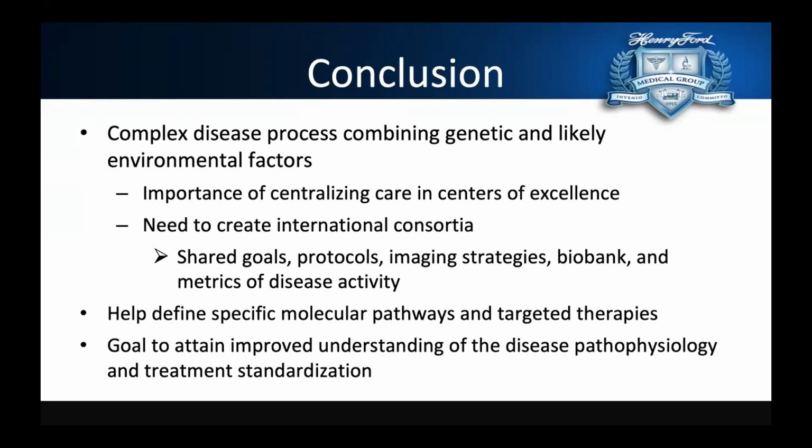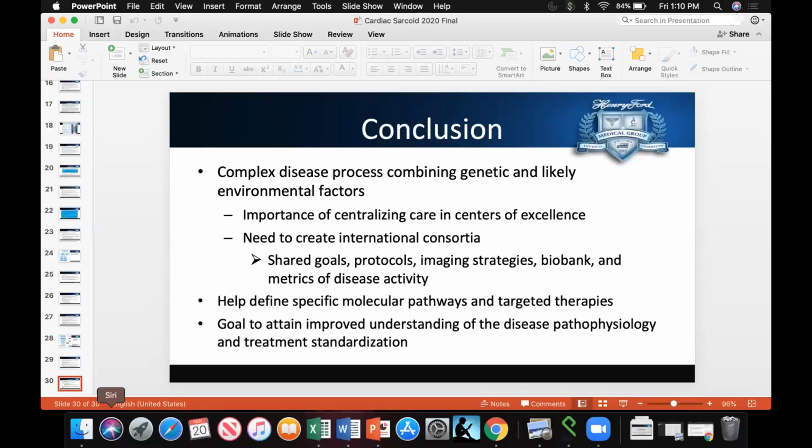It's challenging to follow treatment response with MR, because MR shows fibrosis and there's really no good data to say that fibrosis improves with treatment. And the T2 signal, which is the inflammation signal, is really unpredictable. So we would definitely recommend that all patients who are being considered for initiation of sarcoid treatment, particularly cardiac sarcoid treatment, undergo a baseline PET CT so that PET can be used for monitoring.